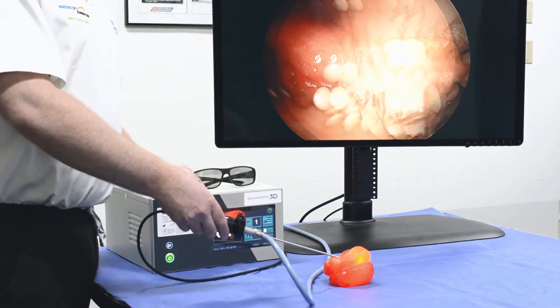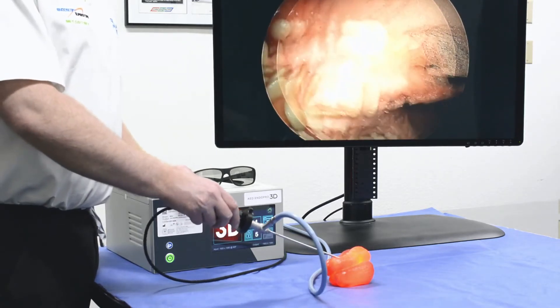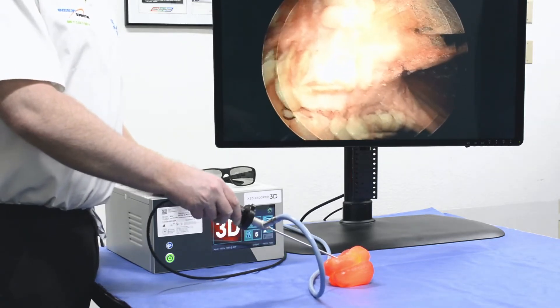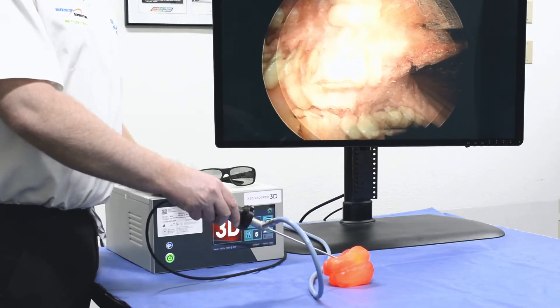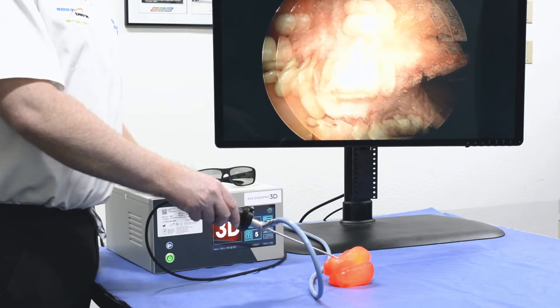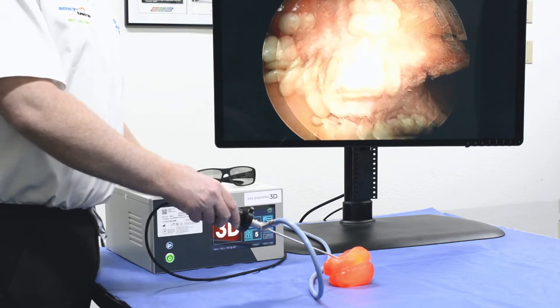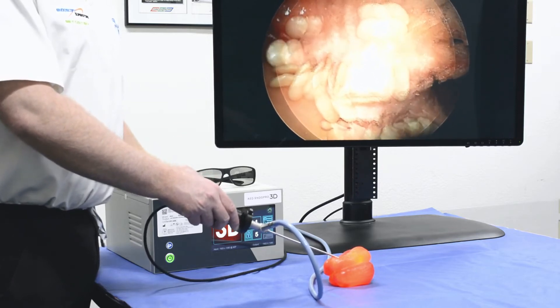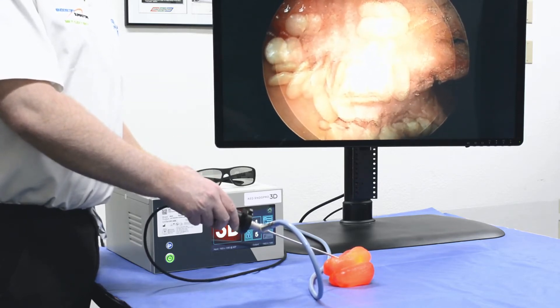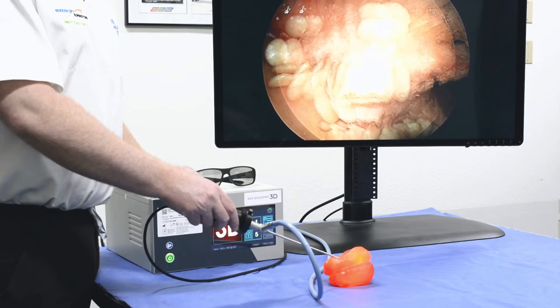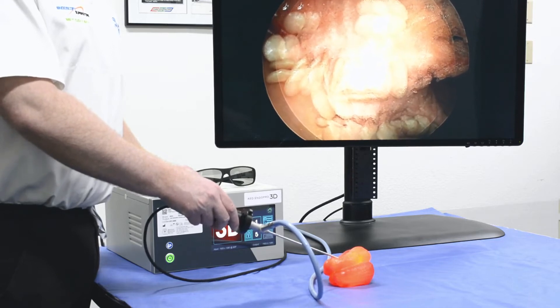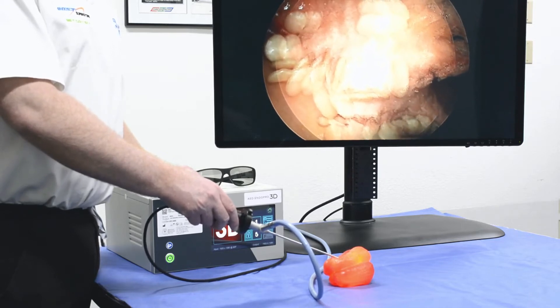There have been a number of specialties that have never had the benefit of 3D before now, such as endoscopic skull base, middle ear, maternal fetal, and endoscopic spine.